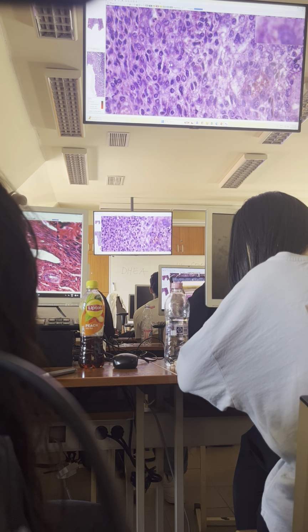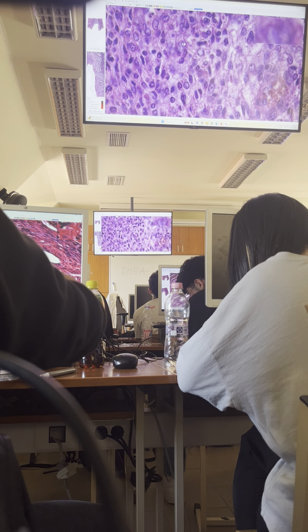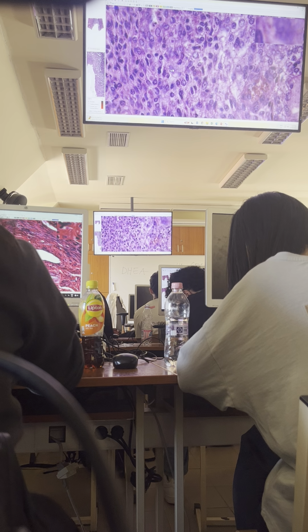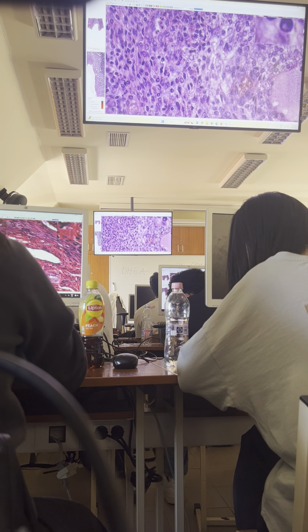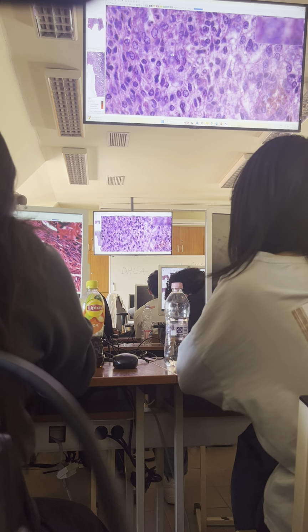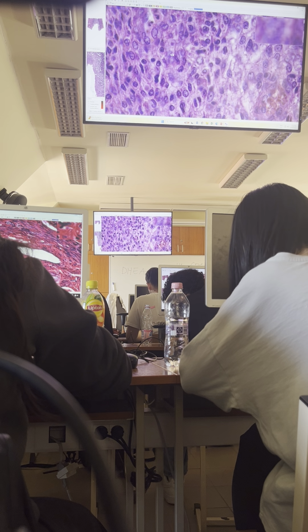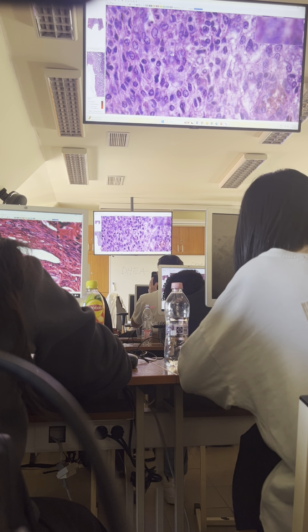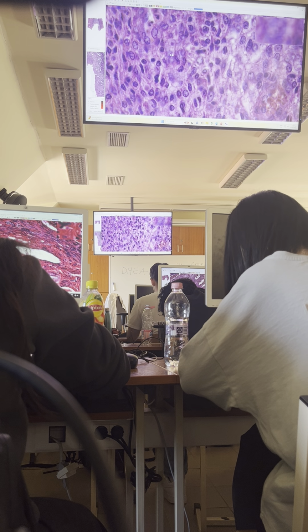Or even these ones even better. Where you see these very pale nuclei. These cells are a little bit bigger than other nearby cells. Now these paler, slightly basophilic and slightly bigger cells are derived from the stromal cells during the secretory phase.